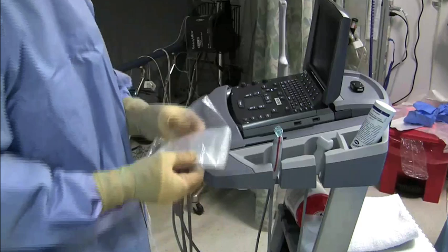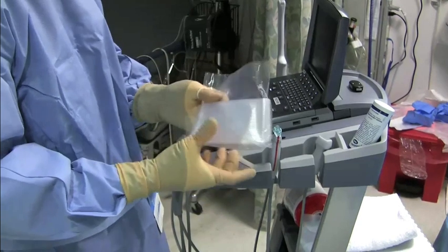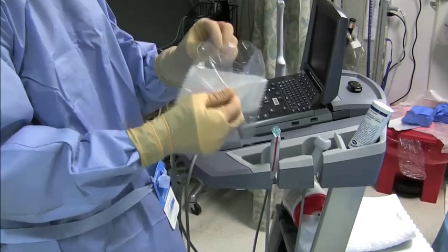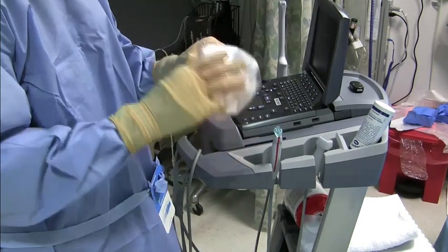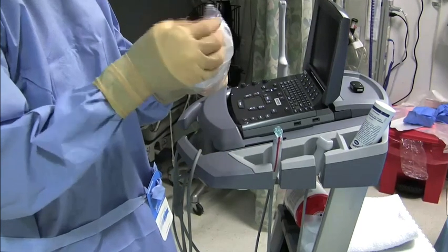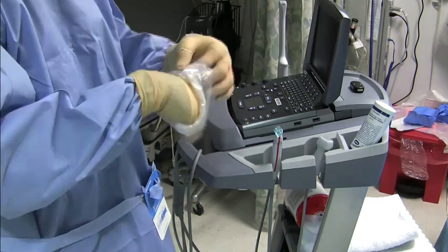The transducer sheath is basically a long plastic sock that is sealed on one end. You will open up the transducer sheath, place your hand through the open end, and this is so you can invert the sheath over your dominant hand through the closed end.